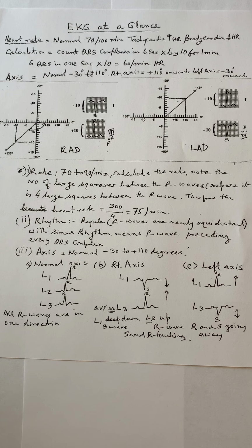It's not difficult. This is one way. Another way is a fixed figure which you will learn from the speed. It has been calculated, that is 300.